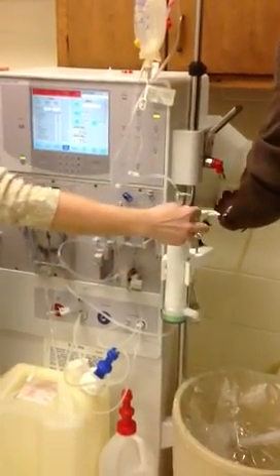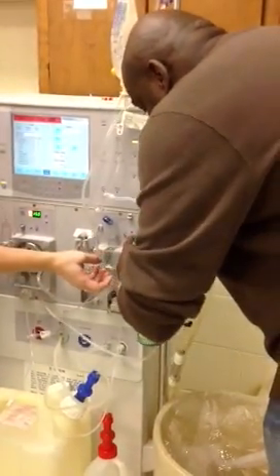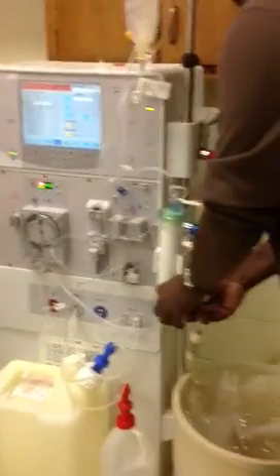Then slide the silver part back, put it on, and push the silver part forward. And it locks it. Now take the other cap off and do the same for the red.